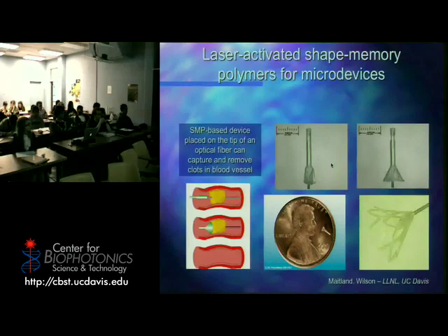Problem, right? We know that living tissues, if they don't get their fresh oxygen, are in trouble, and that travels through the blood. So we need to somehow get rid of that clot. What can we potentially do? We can make a cut in your big artery here in your leg and push that fiber optic through your arteries. A tiny little thing, 1 millimeter in size. Push it through, snake it around. Oh, I have to make a bend over there, a bifurcation. I get to the clot.